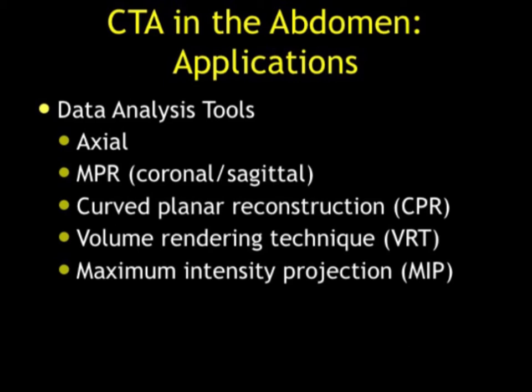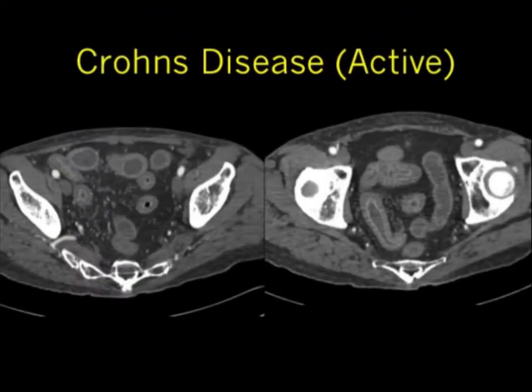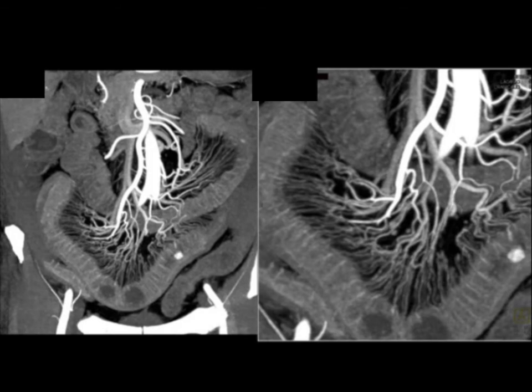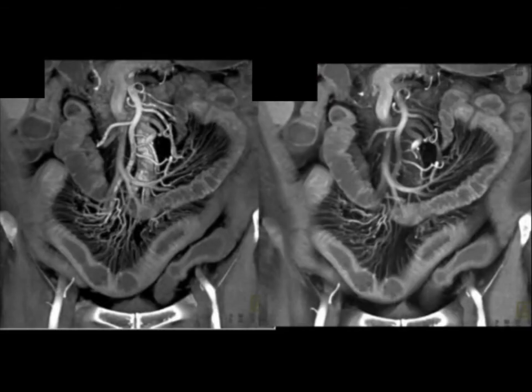I like to show this case making the point that yes, you see the Crohn's thickening and small bowel here with mucosal enhancement. But you see it a whole lot better on the coronal and appreciate the extent better. You see it much better when you look at the MIP imaging and see the vascularity and the comb sign, and even better on the volume rendering where you see the thickening of the bowel and the vessels. It really is a combination of techniques that optimize visualization.